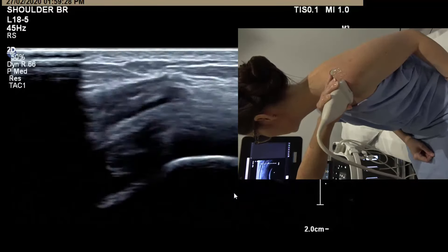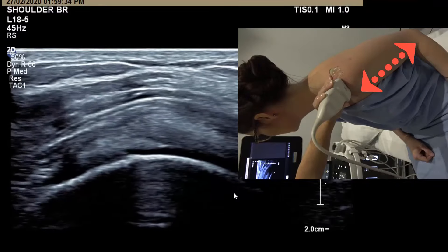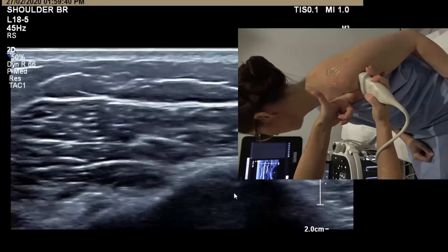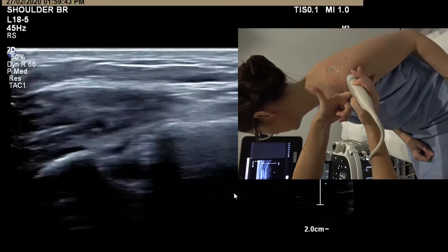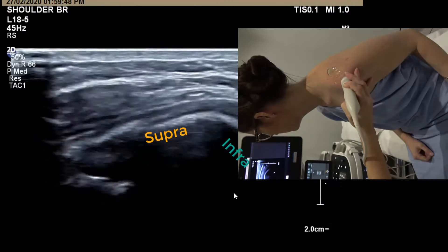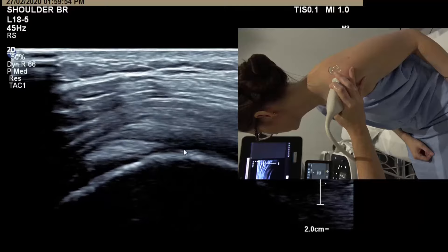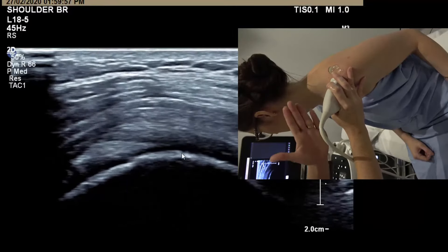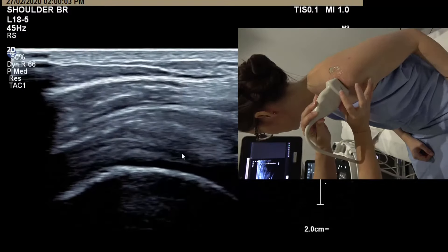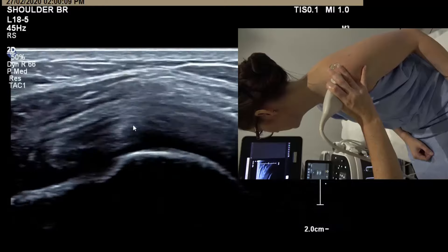Imagine where a seam on a shirt runs or a bag strap — that's the orientation of the camera. Start down at the groove, run up from a sleeve view over the crest of the shoulder. You can see the facets for supra and infra, then fall onto the cuff view. Overshoot slightly by going too close to the neck, then lay the camera a little bit flat towards the patient's face to get a nice bright interface over the anterior fibres of supraspinatus.